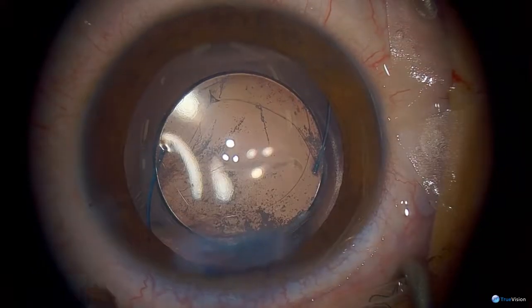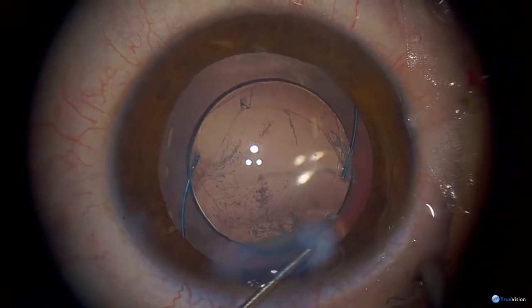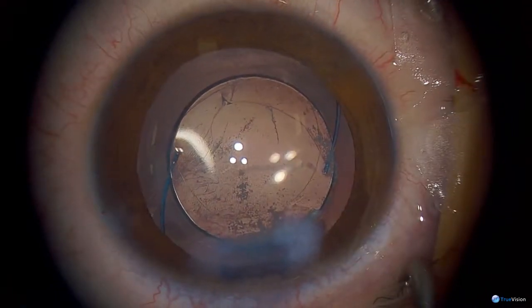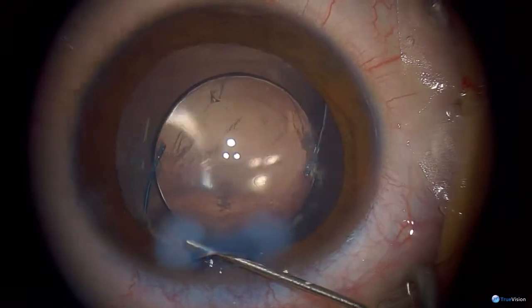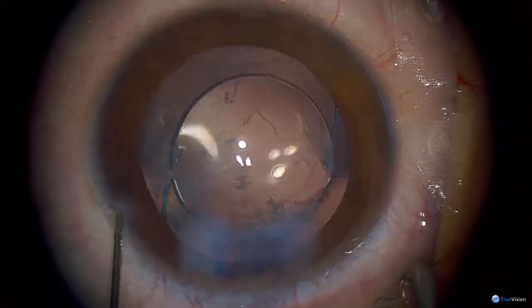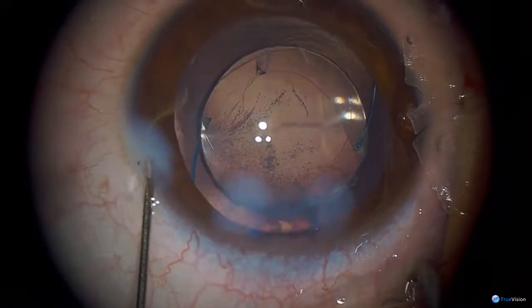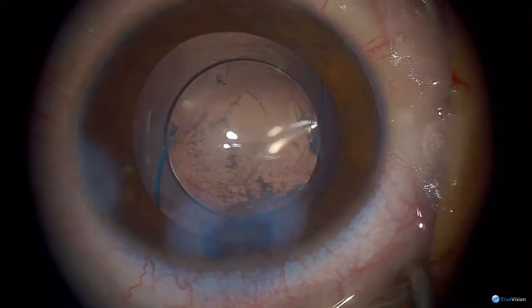If he wants to read with both eyes he'll have to have a plus lens in front of the left eye. Why don't you use triamcinolone to make sure there is no vitreous in the capsular bag? Because at this age the vitreous is very thick — it doesn't tend to come into the anterior chamber. It's very formed and solid like a jelly, so they don't tend to get vitreous coming into the anterior chamber.